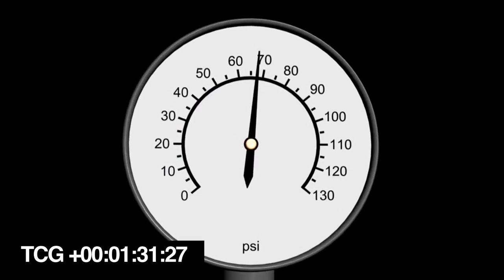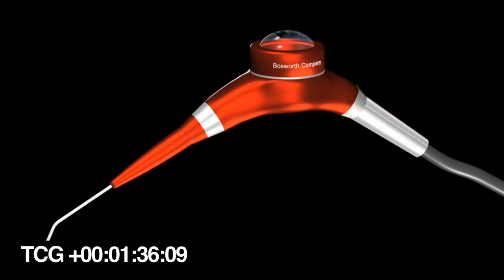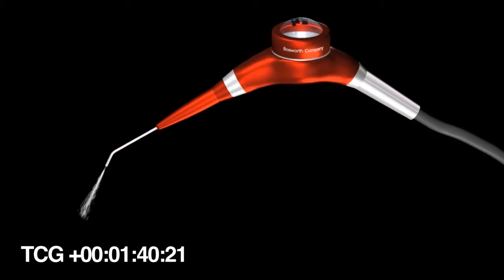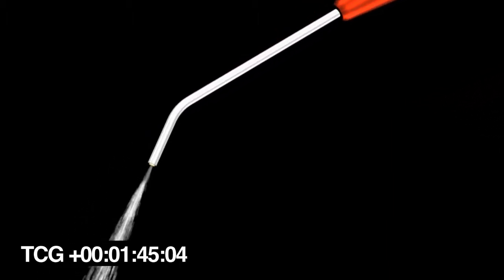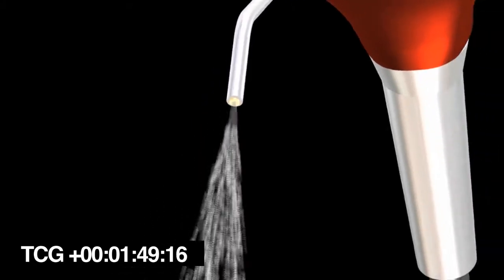Set the dental delivery unit's air pressure to 65 to 70 psi. When set to the correct air pressure, the unit will emit a steady stream of air, water, and Profi powder. This is optimum in order to operate the air polisher properly and to avoid clogging.